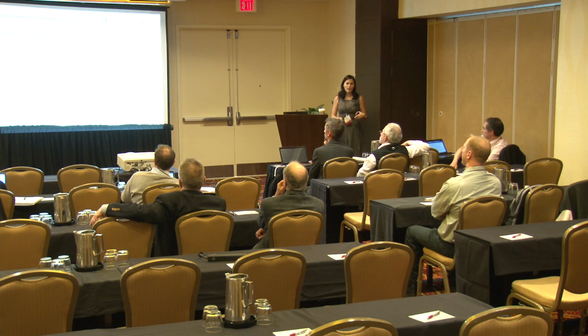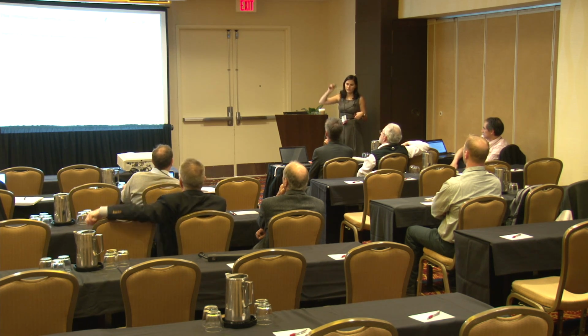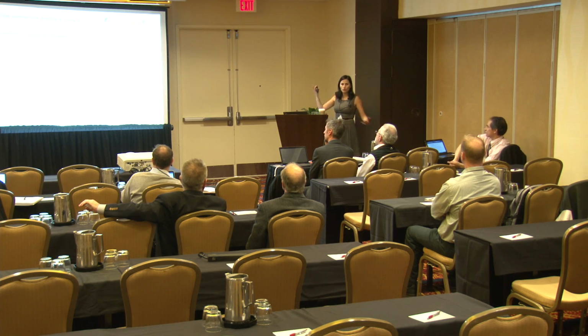You can also add numerical values like the median for each observation, and also the sample size, because sometimes we see a certain effect, but we want to know how many subjects or observations contributed to this effect. Sometimes it's too low to be meaningful. And you can use these options separately or combined.